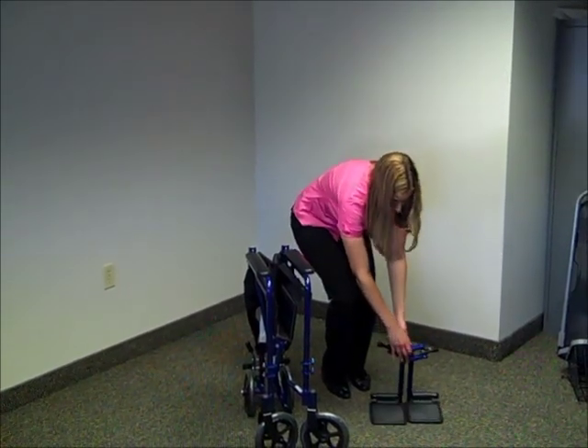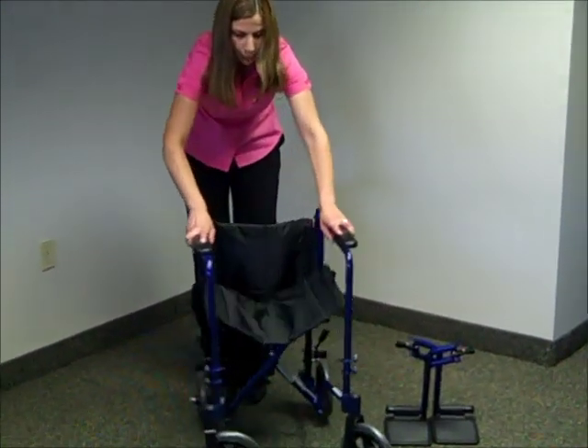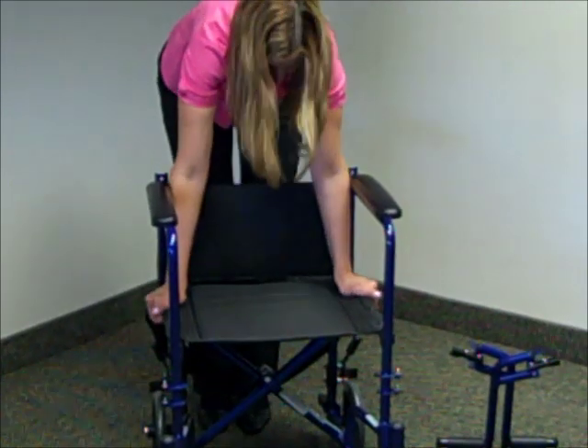The first step to open your chair is to grab the armrest and pull it apart. Make sure you press down on the seat just to make sure it's fully opened.